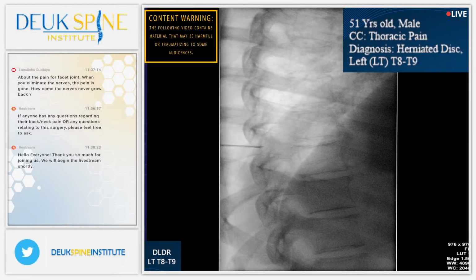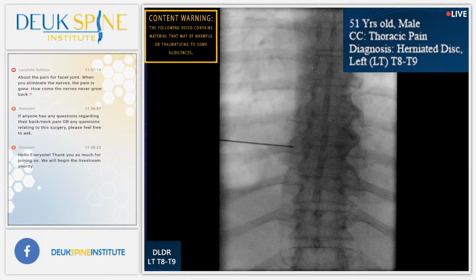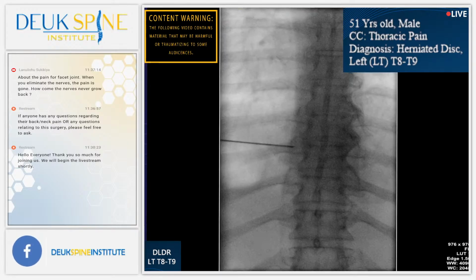Now the patient is awake, they're not intubated, they're on propofol, so they're sedated, they're sleepy. Twilight we call it, and I need his cooperation. There we go, it looks pretty good. Looking good, our lung fields are nice and full. We want to avoid any kind of lung issues.